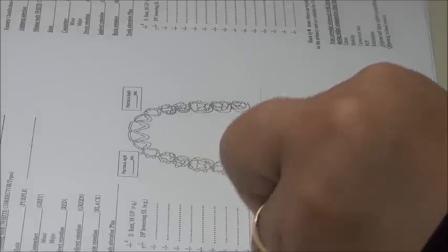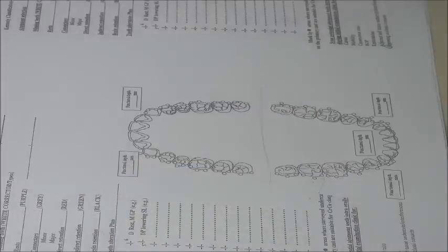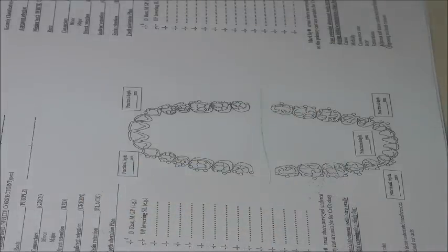There's no undercut on this tooth and I forgot to do the enamel dimple. Okay? That's why you need to write down very well any teeth preparation that you need. Although it's written tooth alteration plan, it also includes mouth alteration plan, because sometimes you need surgery. You plan the patient to go for surgery, for example.